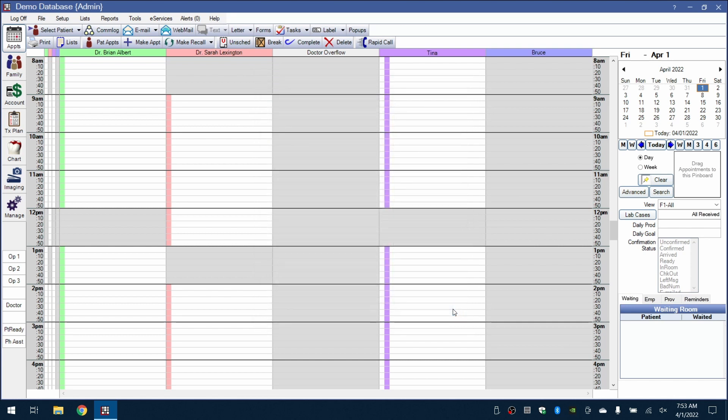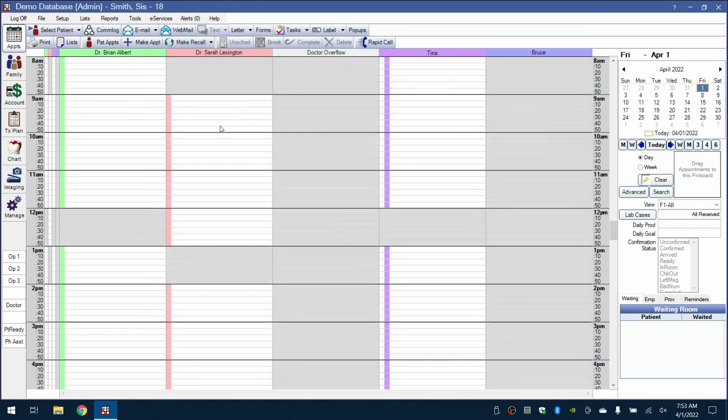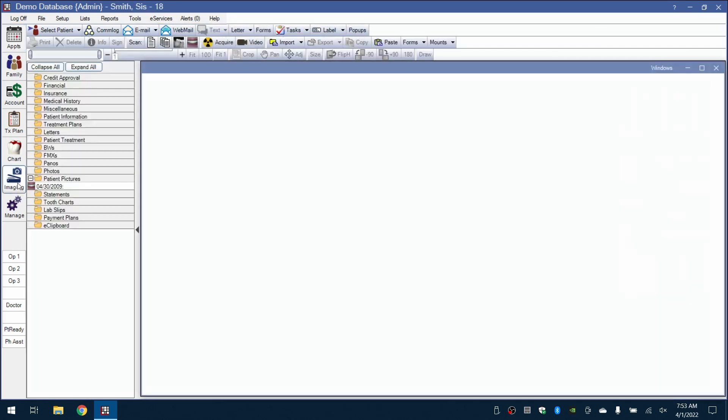Now let's acquire a four-bite-wing series. We'll select a patient, go to the Imaging portion on the left side, and select the field which we would care to store the images.